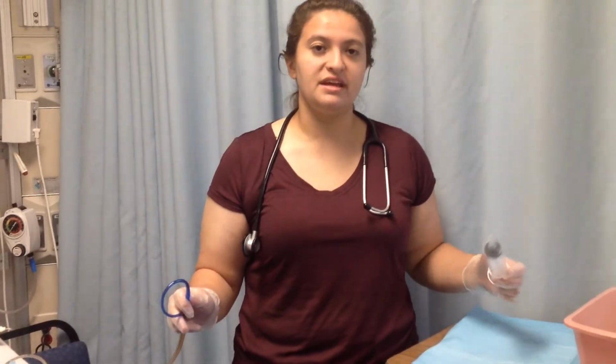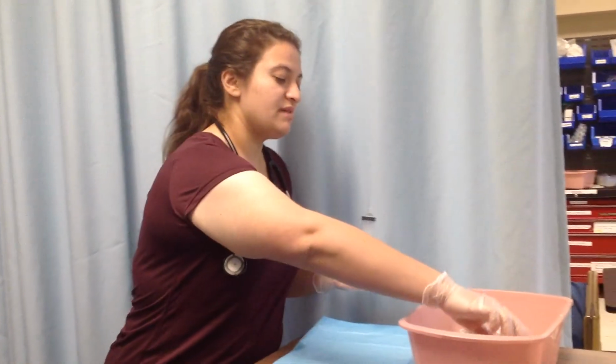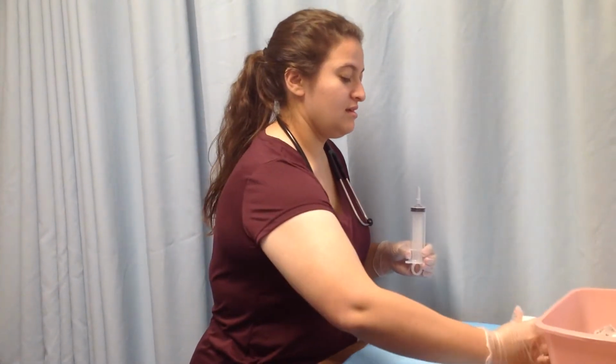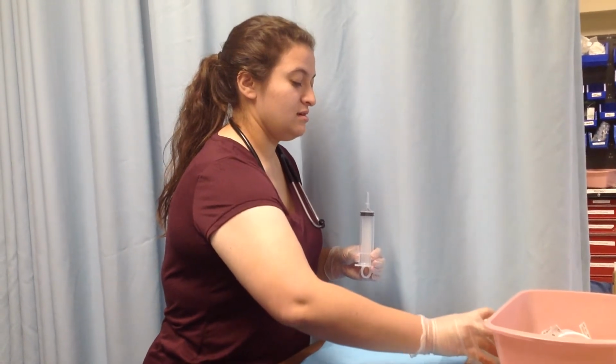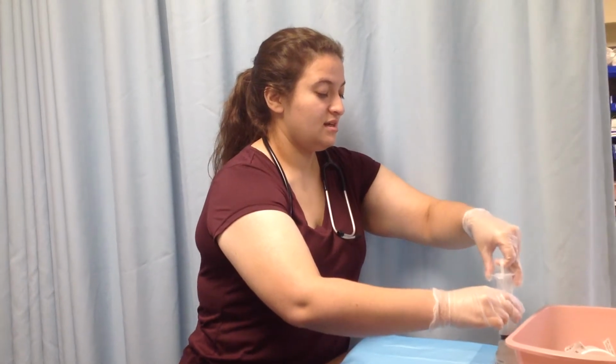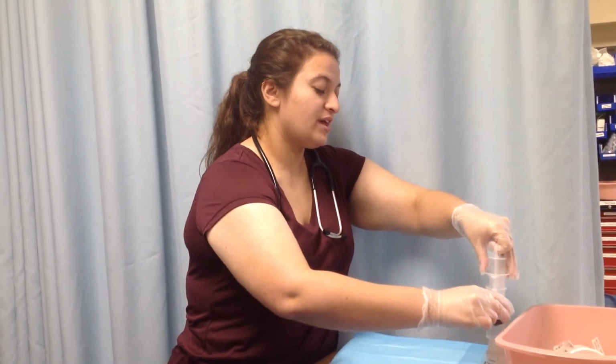Once I've done that, if at any point my syringe is a little dirty, I would make sure to wipe off any contents with the other clean side of the blue pad, or any paper towels. And then I'd place that back on the patient's bed, and I would grab my saline solution. I want to make sure that it's not tampered with, it's not expired, so I would uncap it, place it on the patient's bed, and then grab about, ideally, 20 to 30 milliliters of solution. We'll say I'll grab 30.